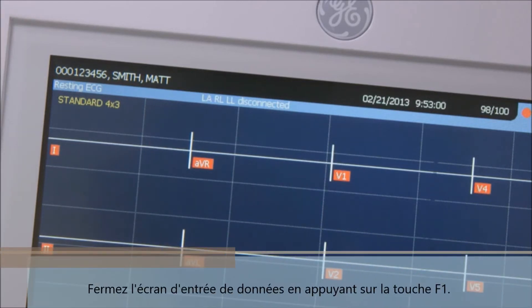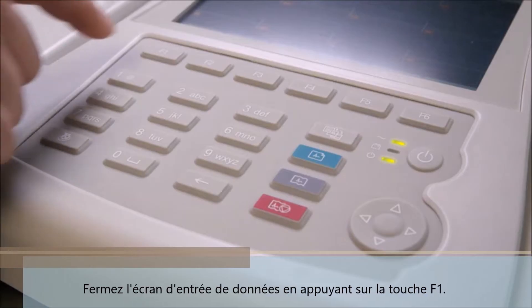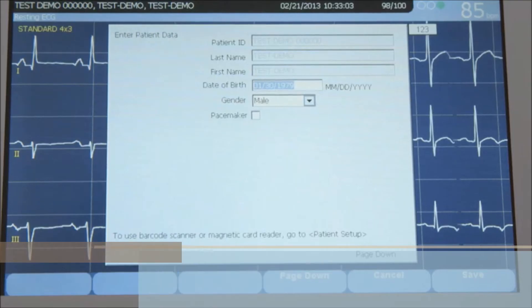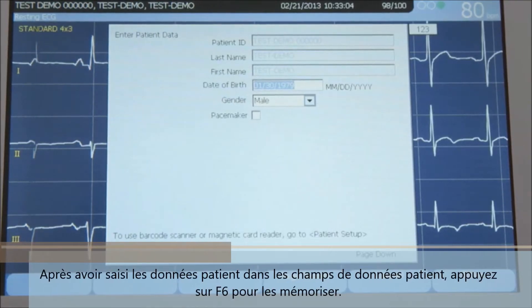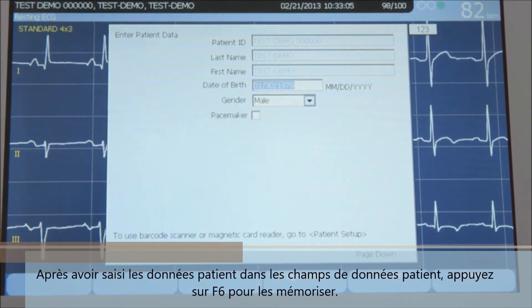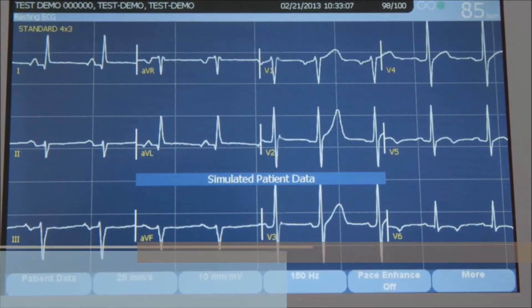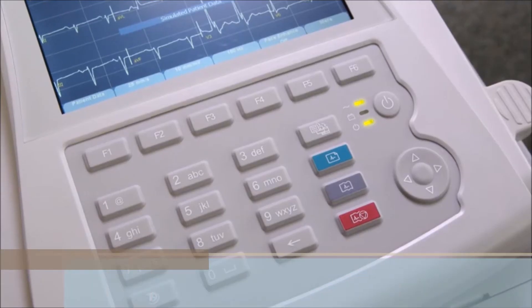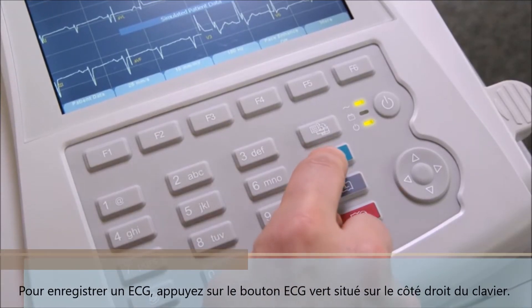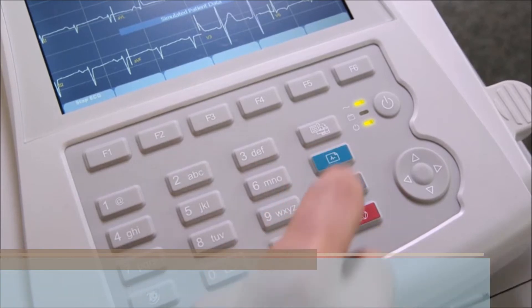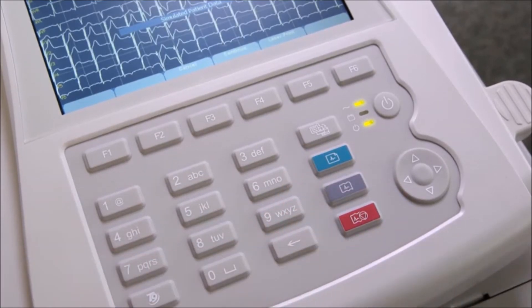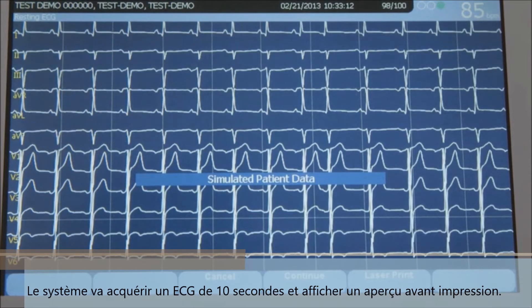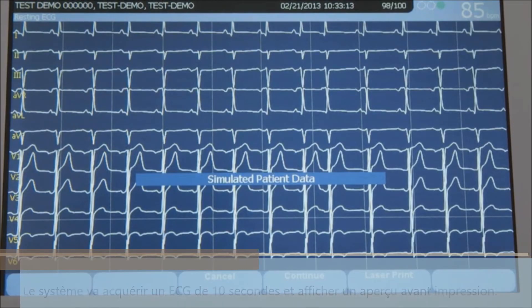Press F6 to save and you'll see the patient data in the top left side of the screen. Close the data entry screen by pressing the escape or F1 cancel key. After entering patient data, press F6 to save. To record, press the green EKG button on the right side of the keypad. The system will acquire a 10-second EKG and display a print preview.